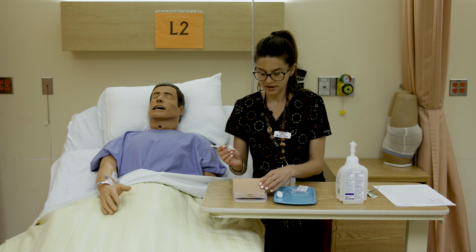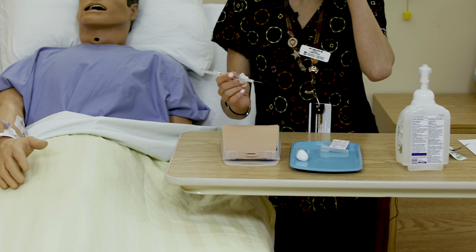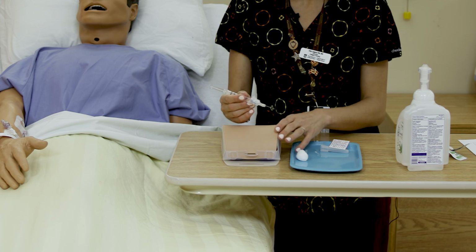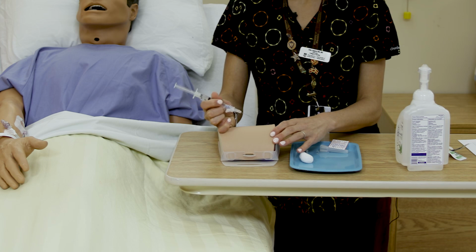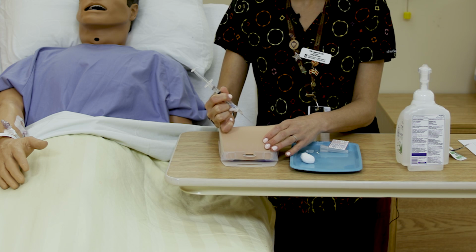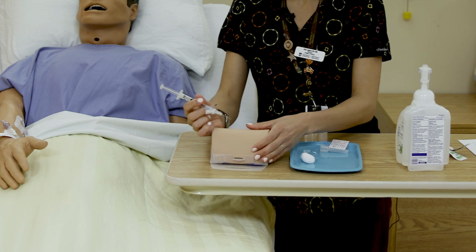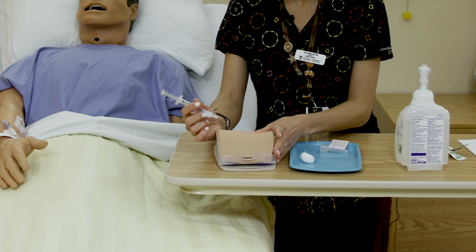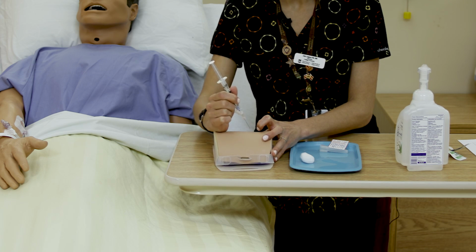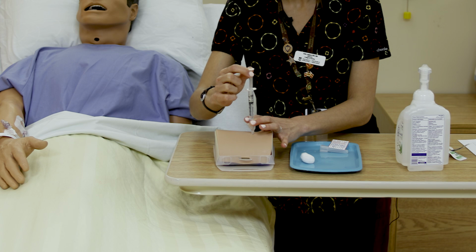Similar to the subcutaneous injections, it helps to stabilize with the ulnar aspect of your hand. But because you're not grasping the tissue, you do have your non-dominant hand to use as well if you need. I like to pull the tissue aside, and with IMs, we're going to go at a 90-degree angle. If you can pull it aside and obtain that 90-degree angle and stabilize that way, that's great. But if I do the lateral pull or the pull down with my thumb and inject at my 90-degree angle like this, still stabilizing with the ulnar aspect, I can then aspirate if indicated, as we said, and no blood.